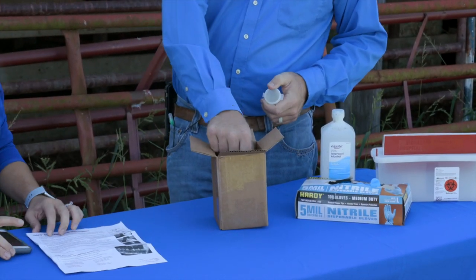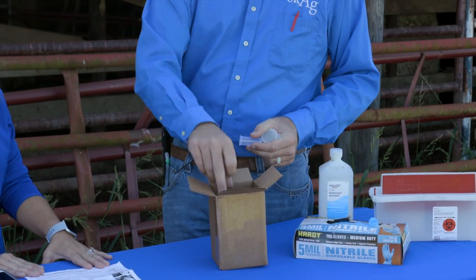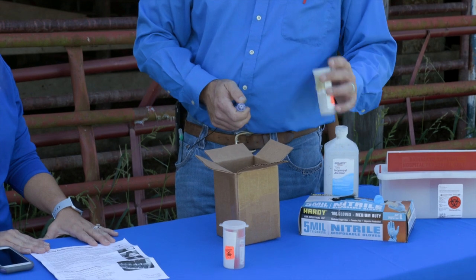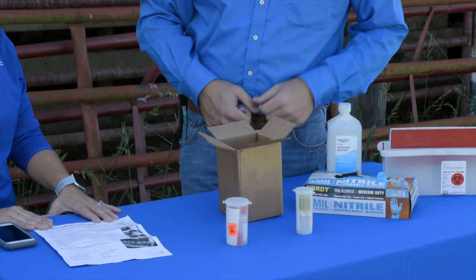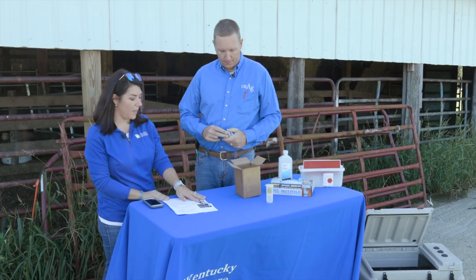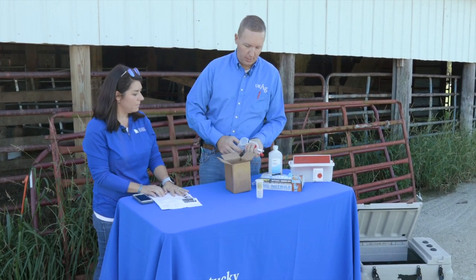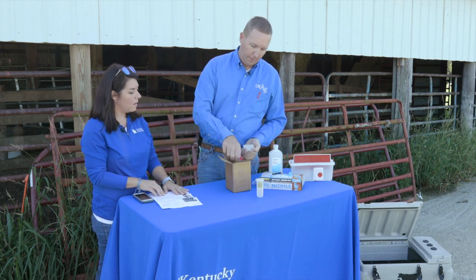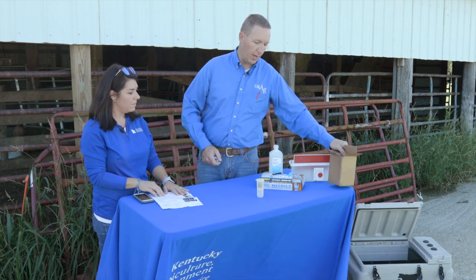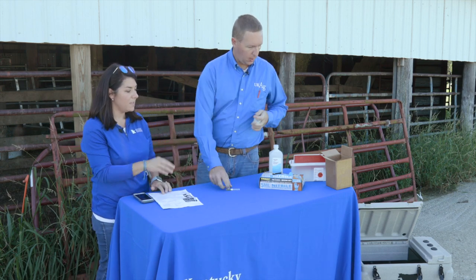Also in the box is a needle holder, which is a very handy tool we'll demonstrate shortly, packs of blood tubes in a biohazard-secured tube that we can ship back, and a tube of needles used to bleed the cows. It's important to use a different needle and a different blood tube on every single animal — we will not cross anything over from one animal to another.